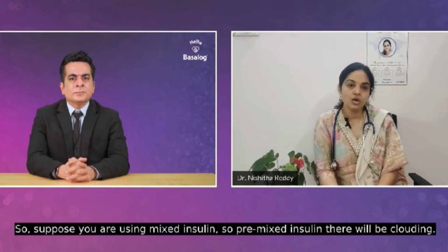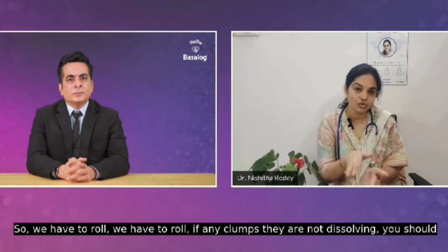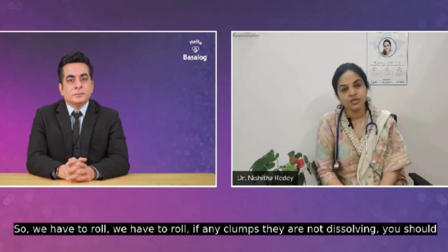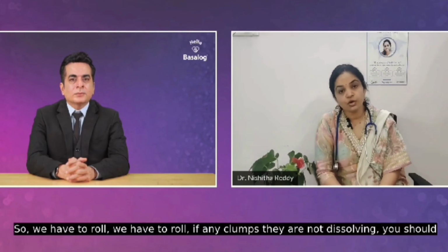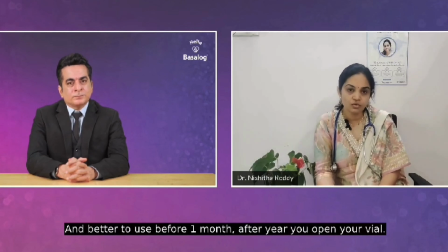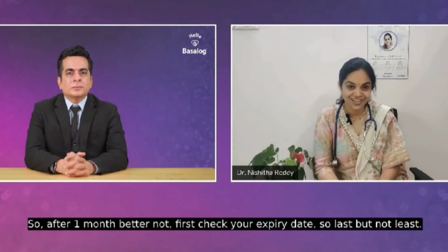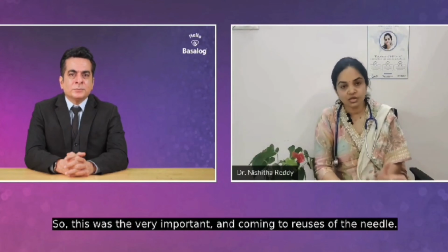Suppose you are using pre-mixed insulin, there will be clouding, so we have to roll it. If any clumps are not dissolving, you should not use that insulin. It is better to use the vial within 1 month after you open it. After 1 month, better not. First check your expiry date. Last but not least, these are very important.